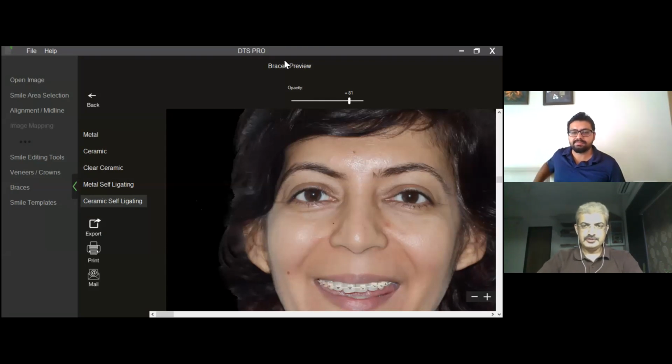And can we use this for storing the data as well? No, the data is still saved inside your computer hard drive. This would be just a platform to process that data.